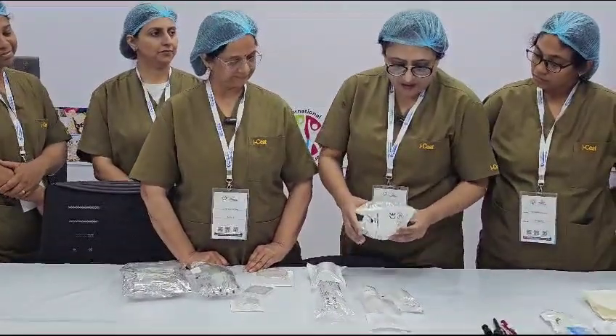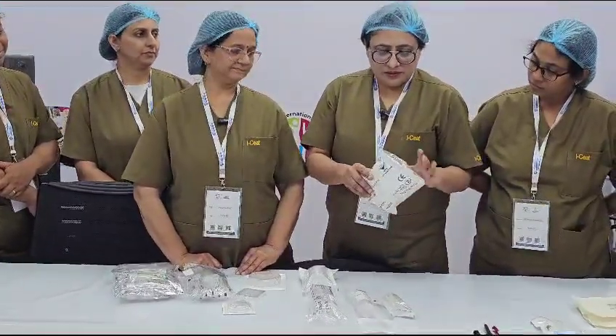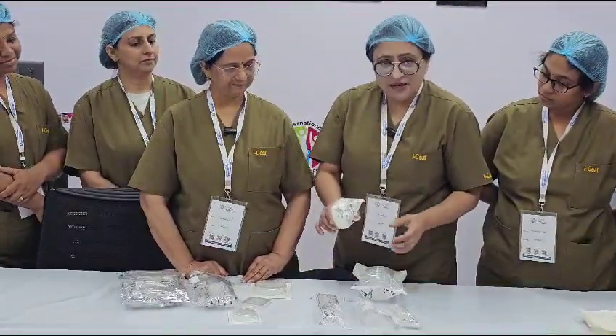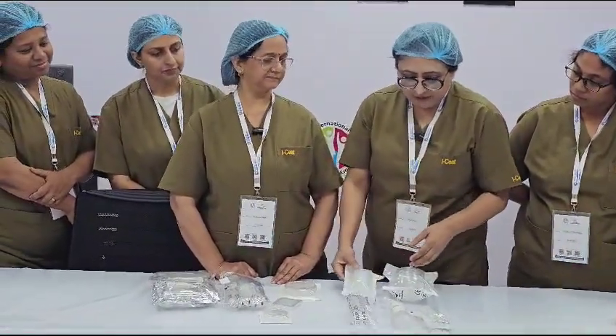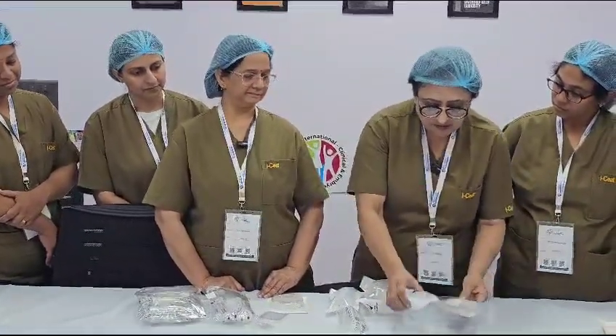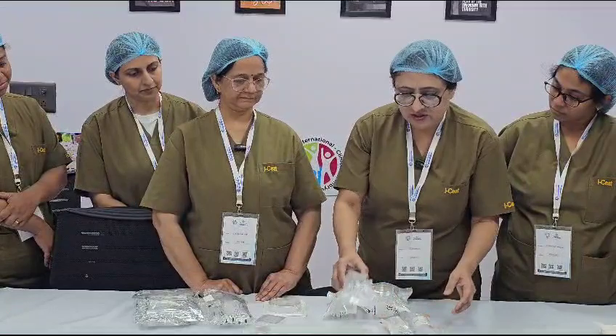Here we have a 100 mm disc which comes in packs of 10, 5, and 2. And this is the 60 mm, which also comes in a pack of 5. And then we have the 35 mm, which comes in packs of 10 and 5. And then we have the central well disc.